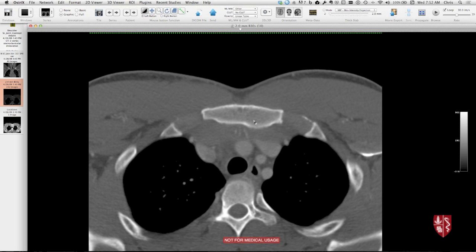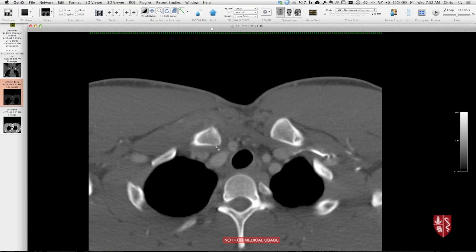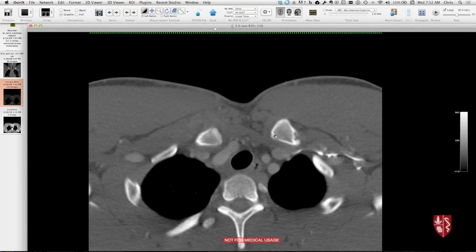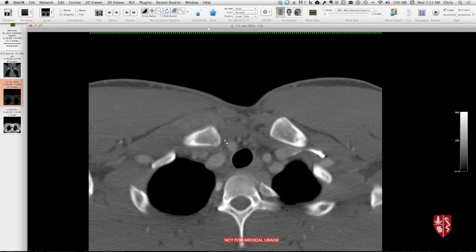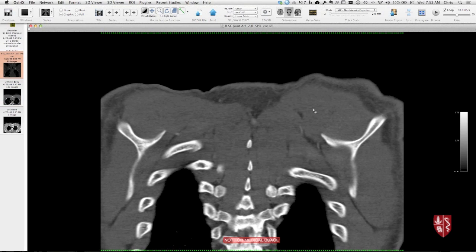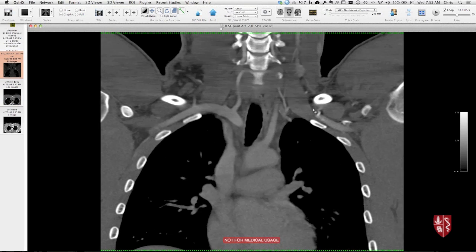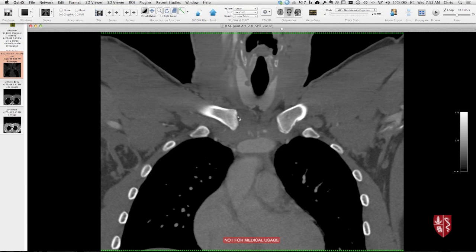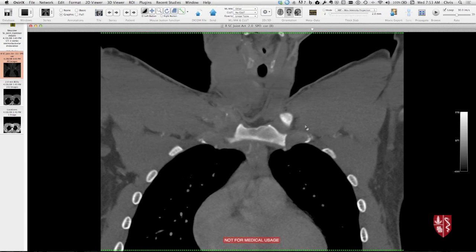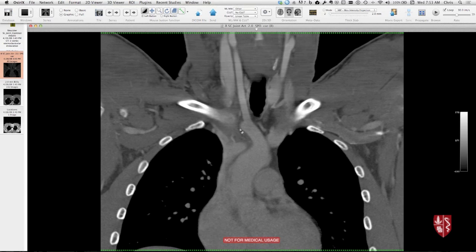And there's some hematoma in here. You can imagine if this gets to be an even higher grade injury or further displacement, you could impinge on local vessels. In this patient there's a little bit of high density in here — could just be some prominent vessels or could be a small flake fracture off the end of the clavicle. Coronal views can be helpful, but again you have to be really careful about paying attention to the alignment. So here's coming through coronally on this nice contrast-enhanced CT. We kind of get through the right clavicle before we get to the left clavicle here. So when you look at routine CTs — your CTAs and so on — be sure to glance at this and ask whether the manubrioclavicular joints are normally aligned. On the left it's normally aligned, but on the right, you have to keep going posteriorly to find that clavicle.